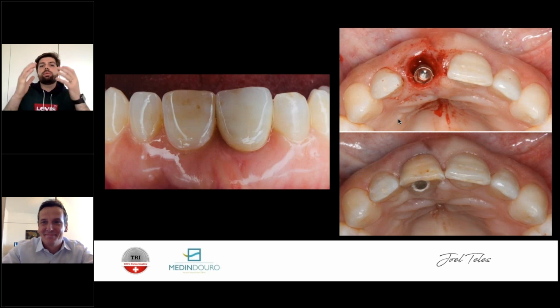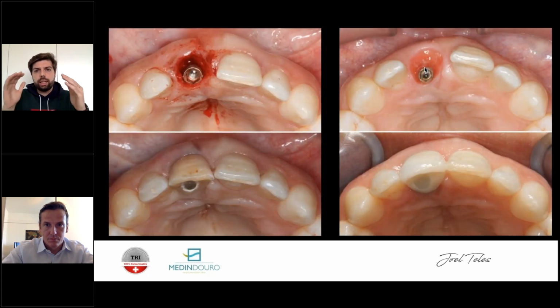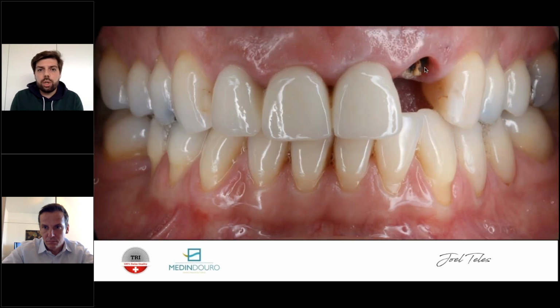So, okay, this is one case that I have shown you a bunch of times now, and you can see the same thing step by step. Implant placed, you do the restoration, you fill the gap, and you can maintain the architecture of your tissues using these techniques and being very careful. And keep in mind, to this moment, we have not discussed any type of tissue graft, only biology, only tissue engineering. So one small tip before we get to the end.